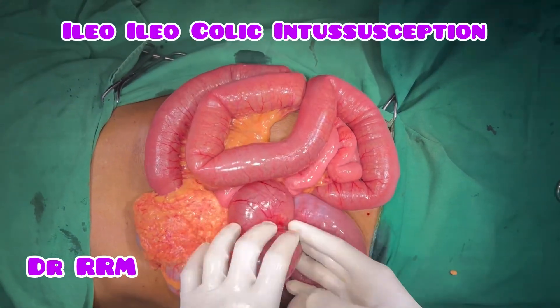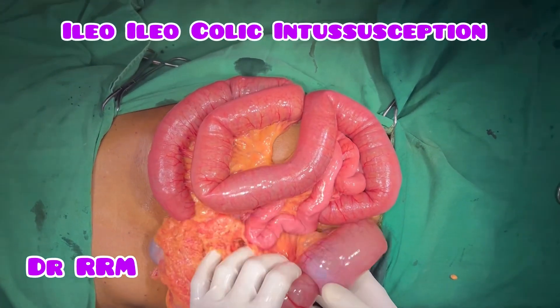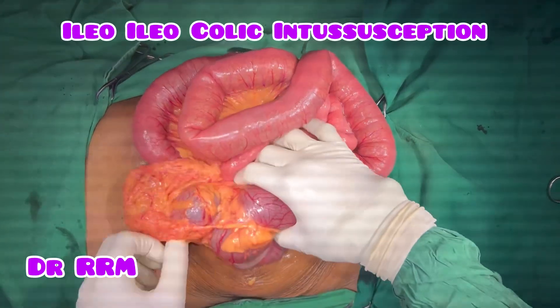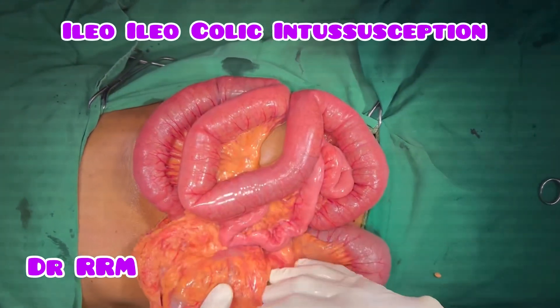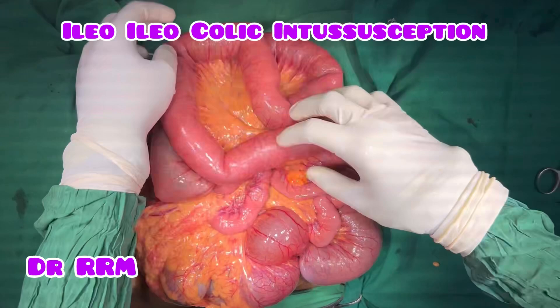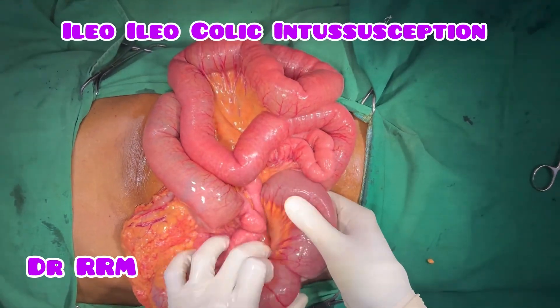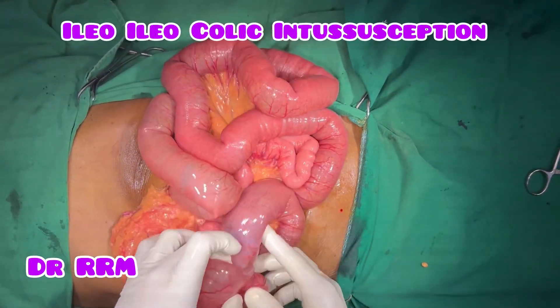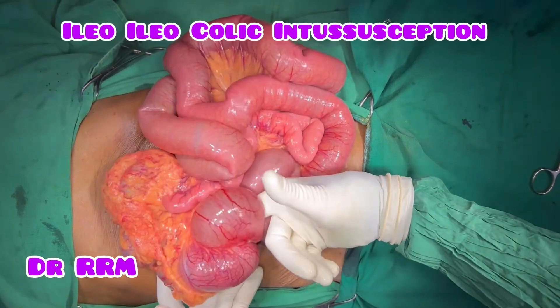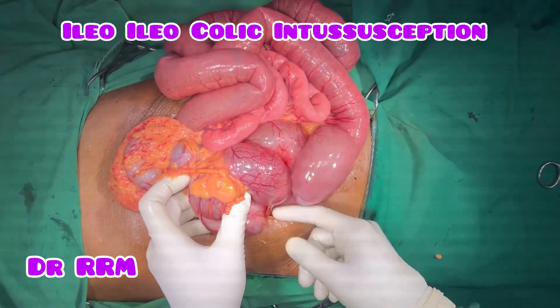We are seeing a case of intussusception. The patient is having an obstruction at the level of the colon. You can see the distended bowel — the small bowel is obstructed. There is an intussusception here: the small bowel is going into the cecum.